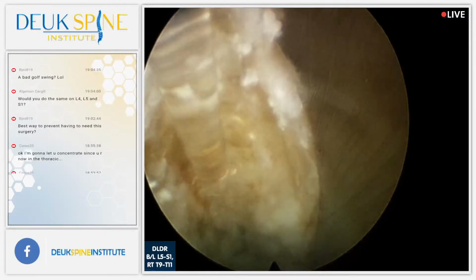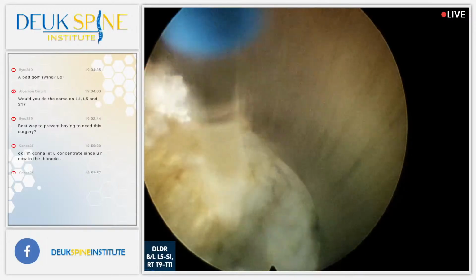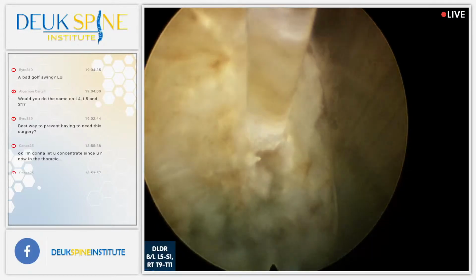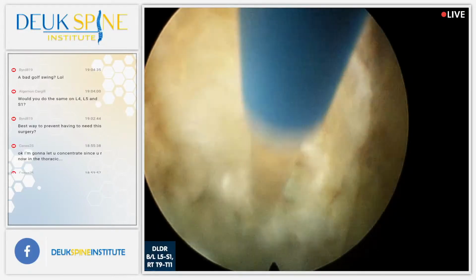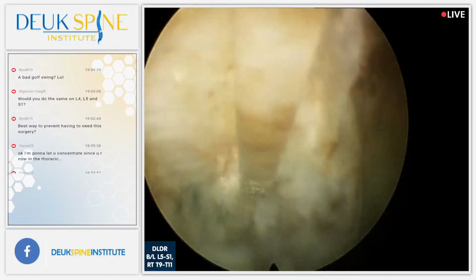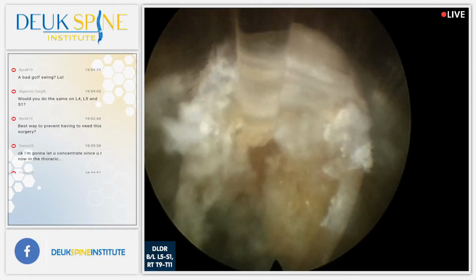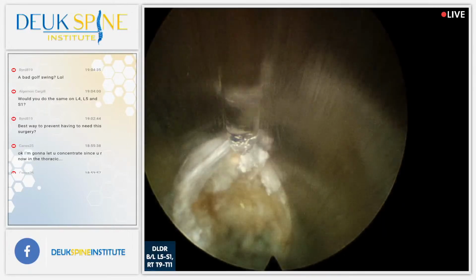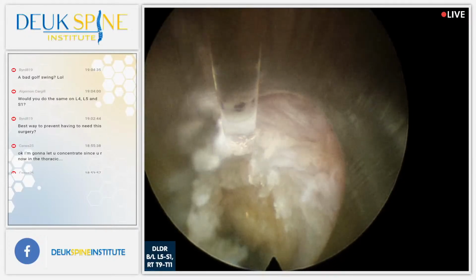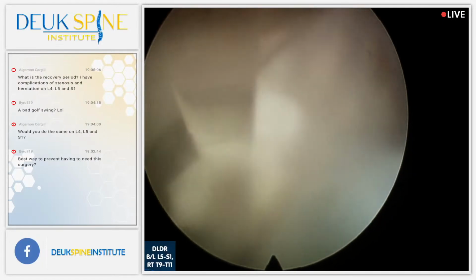All right, we're just about done here. Look at all this scar tissue, all this white stuff, scar tissue from chronic inflammation, not normally found in the disc. This is 30 years old, folks. That's what you're seeing, a 30-year-old disc injury. The blue stuff is recent herniation, and the white stuff is scar tissue. We are done with this disc. I'm going to pull out a little more. We may even see the spinal cord right here, just on the side of the spinal cord. It's crazy, huh? Pretty cool.